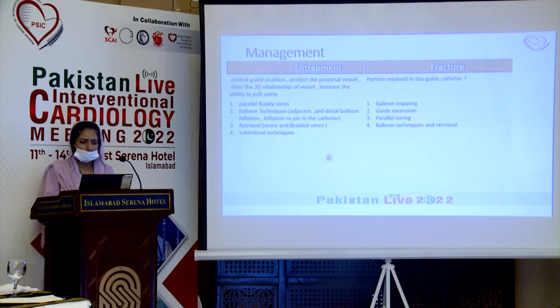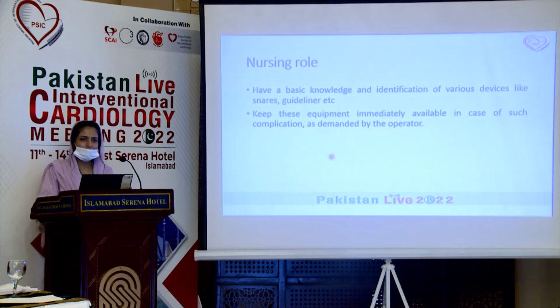This is the management chart for entrapment and fracture for the primary operator. We will discuss the nursing role: have basic knowledge and identification of various devices like snares and guideliners. Keep this equipment immediately available in case of such a complication, as demanded by the operator.